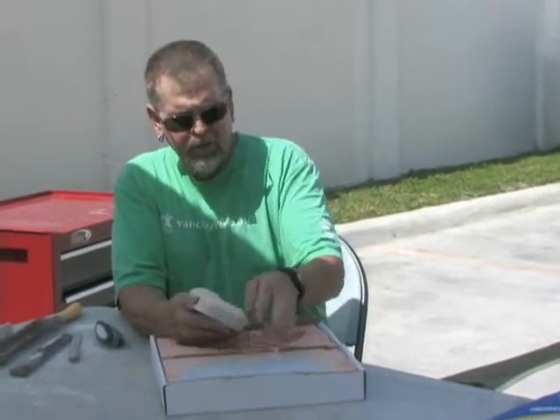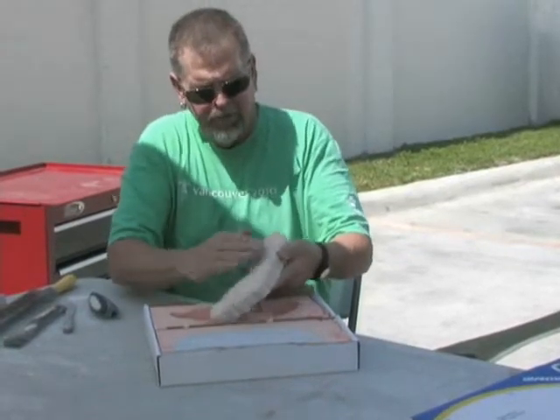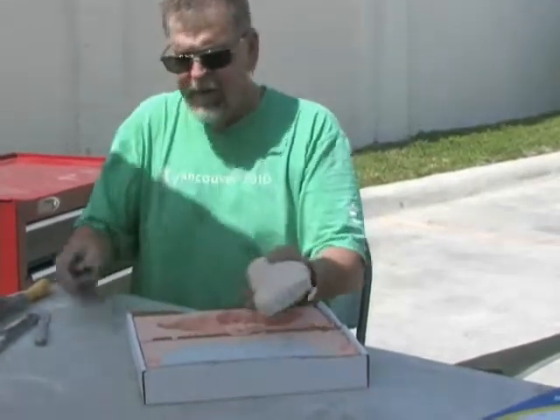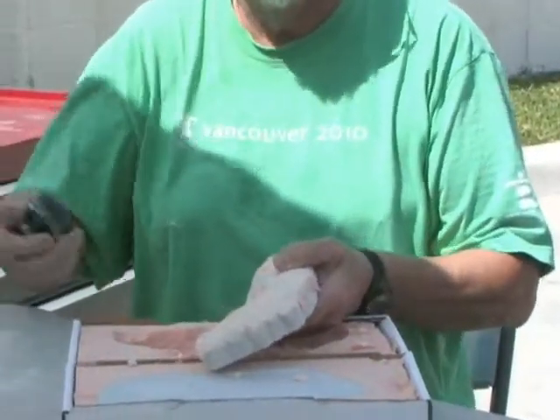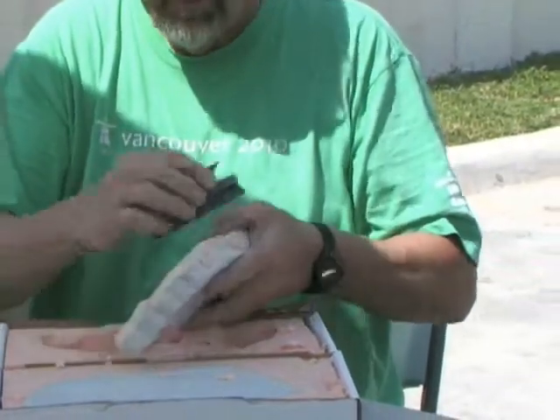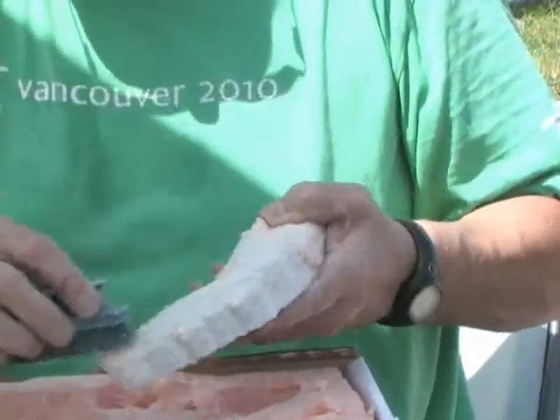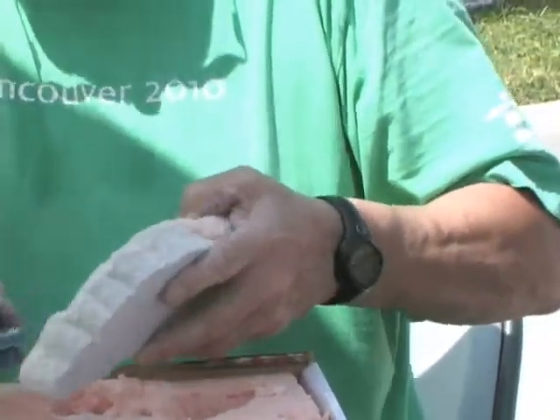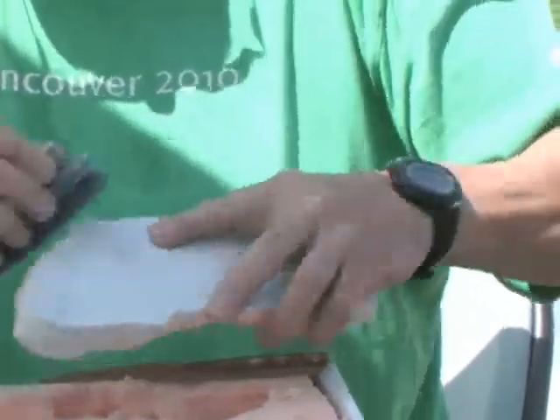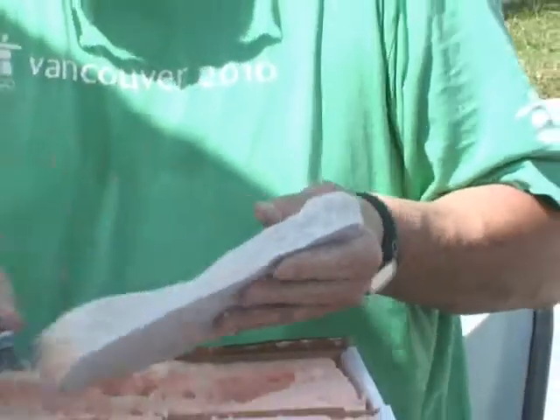I go ahead and brush this foam off with my thumb, try to break some of this excess plaster off right here, then just take a soft brush — you don't need a wire brush because it'll score the plaster. I just take the brush and get the toes so that there's no foam all around the toes.